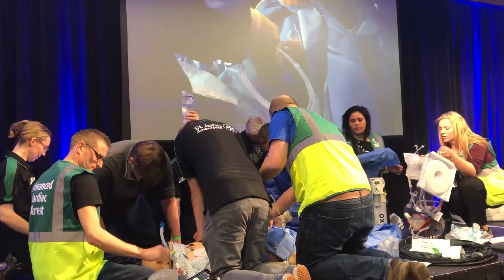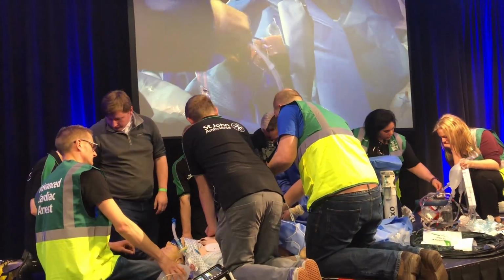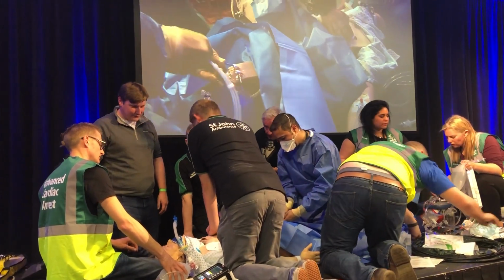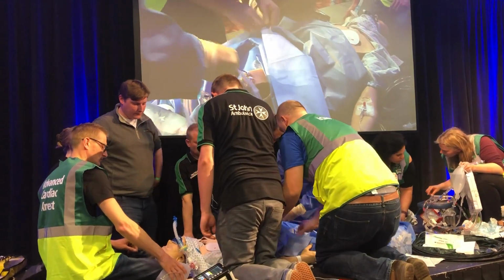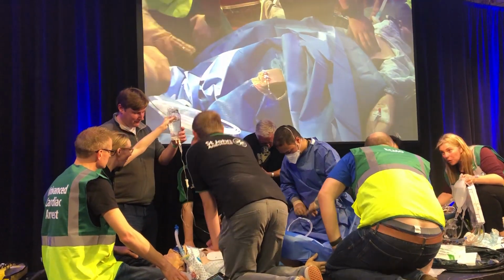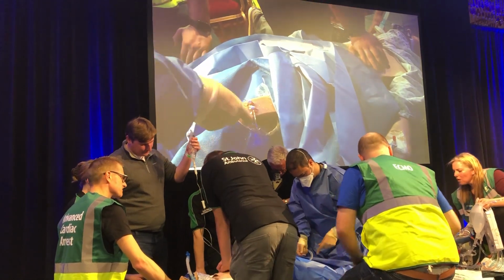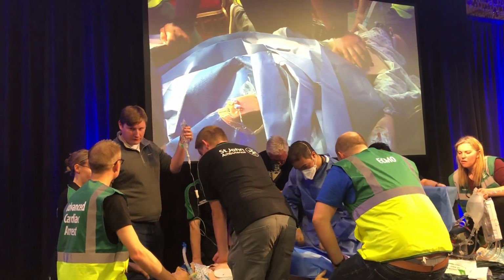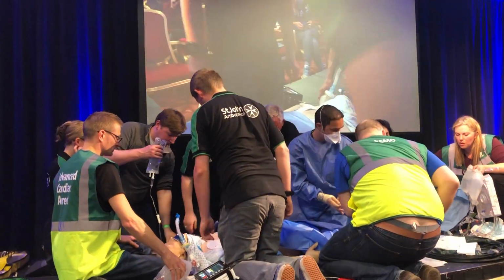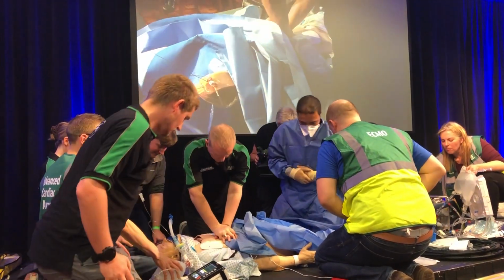We'll accept a 5 to 10% fail rate at percutaneous access to the vessels. In our experience in ECPR, if we can't get wires into the veins or arteries because they're so small, universally the patient dies. It's because the vessels are a reflection of the state of the patient. They've either gone through their catecholamine curve and are so constricted, or they've got such bad vasculature. Every time we've done a cut down in these patients, they haven't survived. So rather than do cut downs in patients that we think are going to die, we will accept a 5 to 10% fail rate, knowing that the ones that we do get in are much more likely to survive.